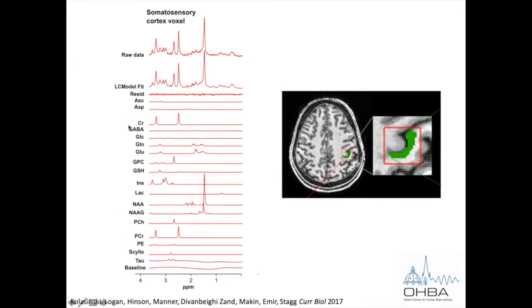and GABA. And I never rescale this slide because I think it is important to say that we can get accurate quantification of GABA, but it's really hard. You can see, I hope you can see my mouse, and you can see that it's really small. It is there, but you sort of have to squint at it. So this is not an easy technique. It does take a long time and relies on people staying very still in ultra high field magnets normally to get it. But we can look at neurochemical concentrations.